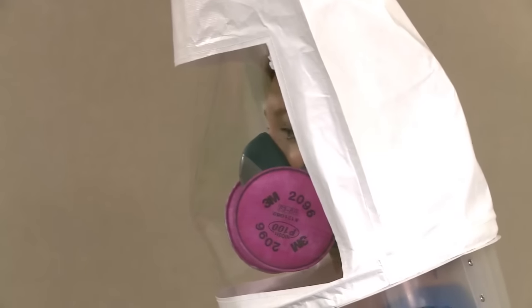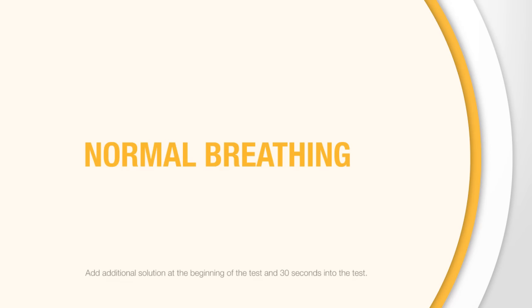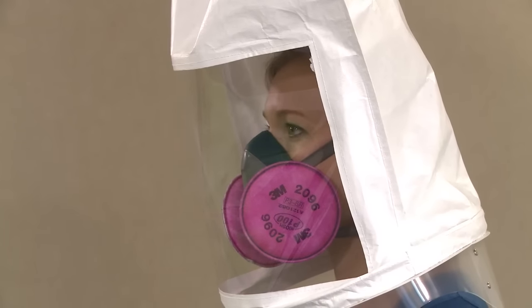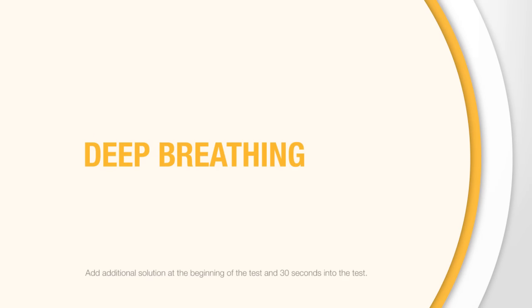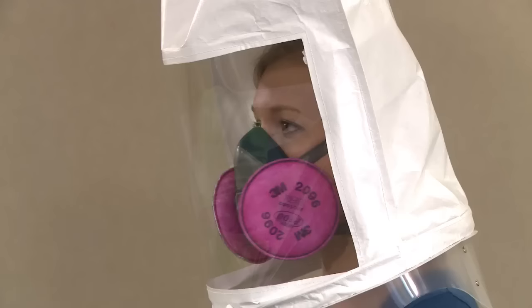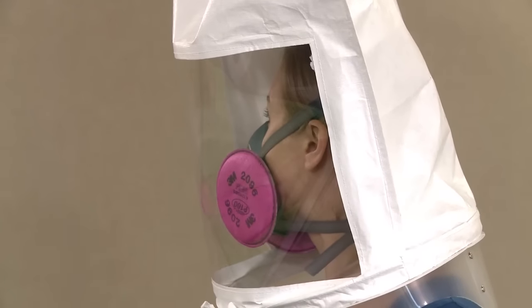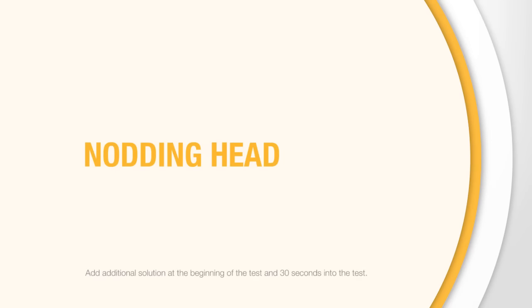Continue to breathe through your mouth during the entire test. Perform the following exercises for 60 seconds each, as directed by your instructor: 1. Breathe normally. 2. Breathe deeply and regularly. 3. Turn your head from side to side, stopping for a breath at each side. 4. Nod your head up and down, holding at each position for one or two breaths.